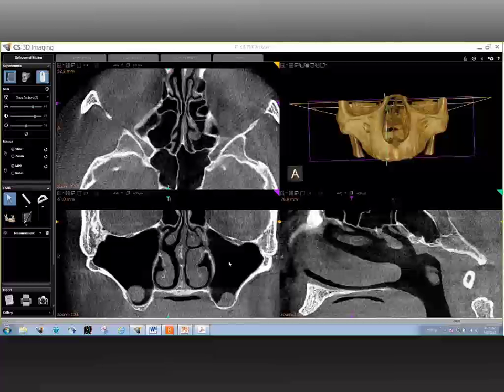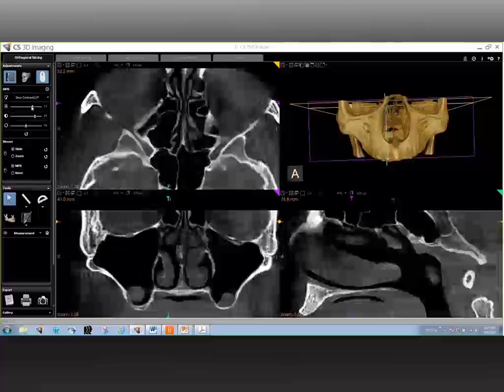So let me understand this better. On a CBCT, regardless of model, regardless of manufacturer, not being able to visualize soft tissue is a characteristic, or better stated, a limitation of this imaging modality. I would exactly phrase it that way. You're absolutely right. Okay.